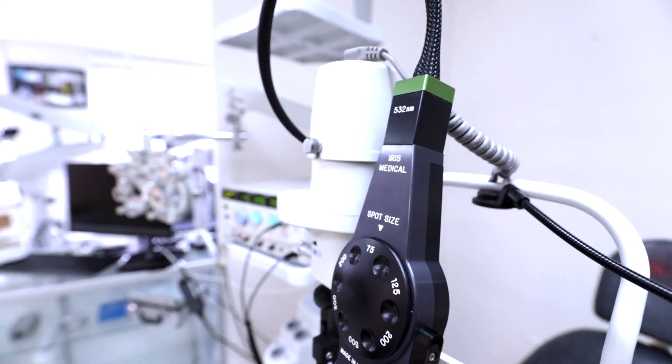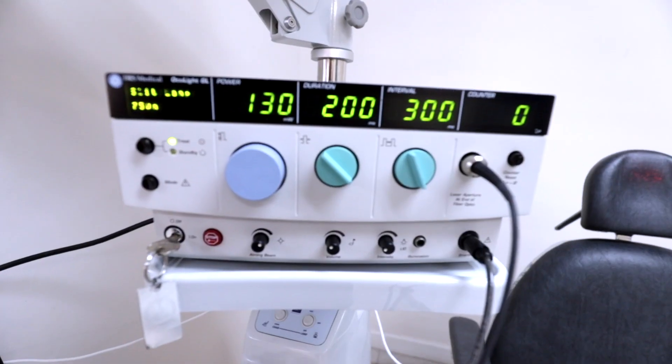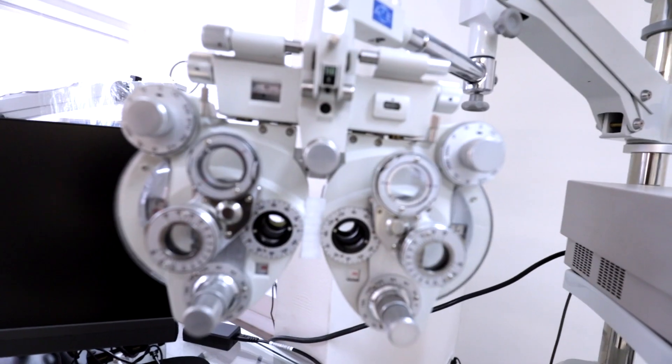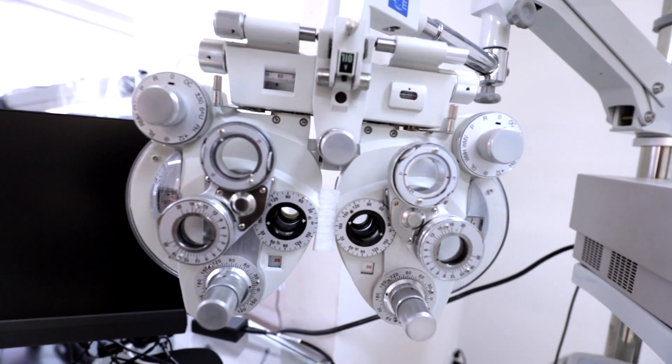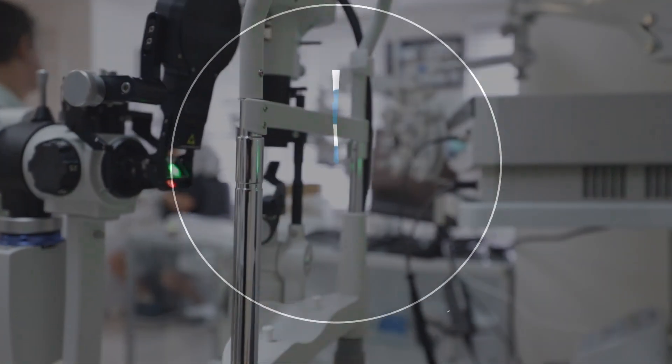The foot switch can be used to operate the laser while reducing clutter. The portable slit lamp adapter provides transpupillary laser photocoagulation capabilities to over 50 models of Haag-Streit, Zeiss, and similar slit lamp systems.